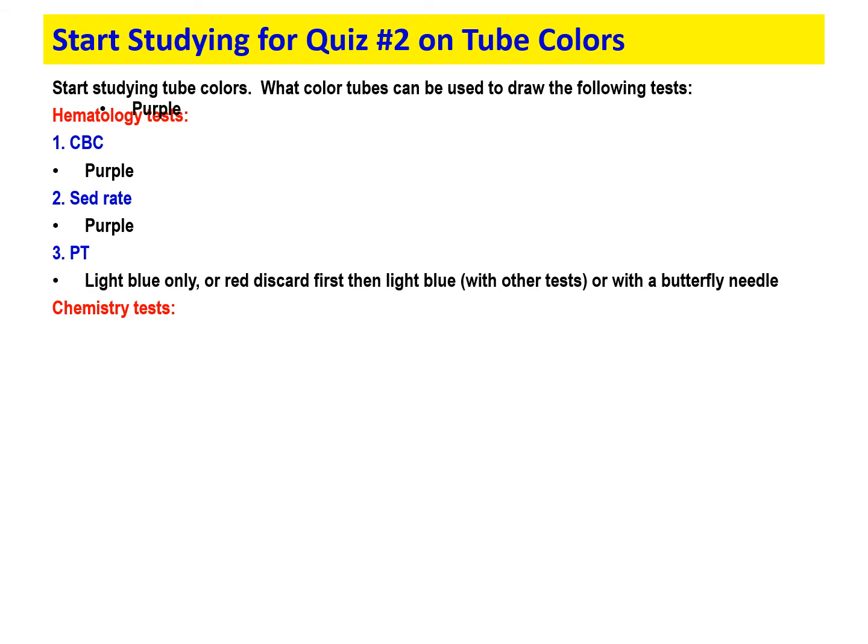So now let's move from hematology tests that are drawn in those purple top tubes or that light blue top tube that is taken to the hematology department. Because remember, not only are hematology tests done in the hematology department, but also urinalysis, and there's a section inside the hematology lab where the coagulation instrumentation is held, and you will take your coagulation tubes to that section of hematology.